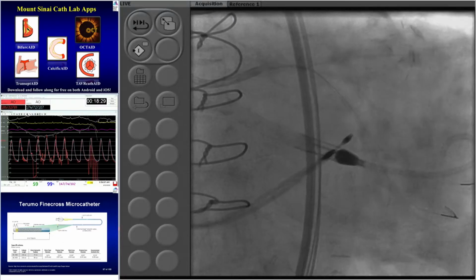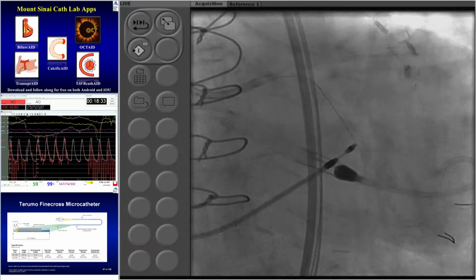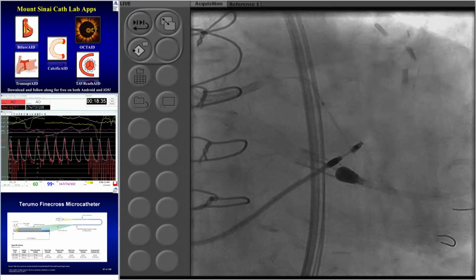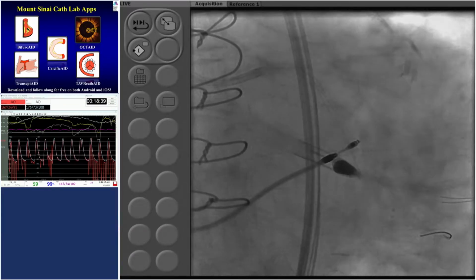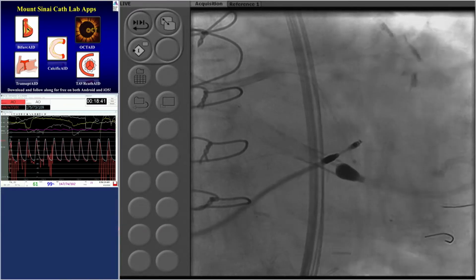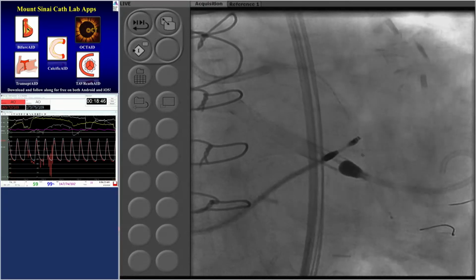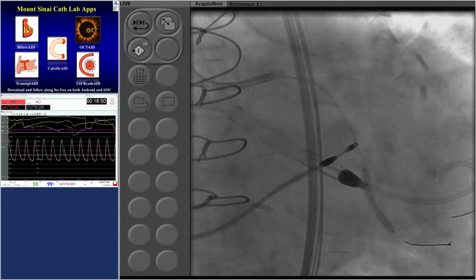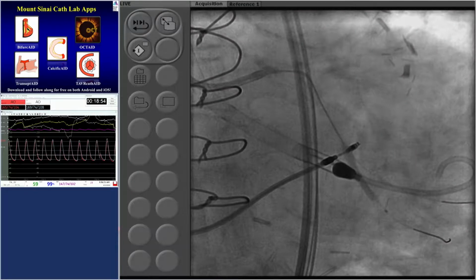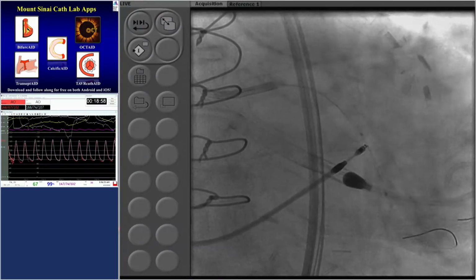I thought that you asked the comparison between the two. Dr. Colombo, you usually use a cutting balloon a little bit, no? Yes, I would consider a cutting balloon in the left main. You have to be careful at the ostium of the circumflex in the angulation, but shockwave is a possibility, especially if the vessel is big and you have a lot of calcium.